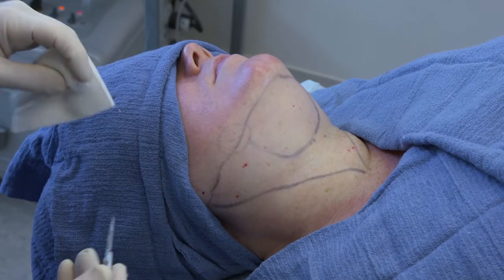give a beautiful outcome. There are multiple new modalities that have been introduced in the past few years to try and accomplish this in a less invasive way. So currently lasers are used to dissolve fat, ultrasound, radio frequency technology, and cold. And all of these procedures can to some degree remove fat, but they can't do it to the same degree that liposculpture can. So I'm going to get started with your procedure.